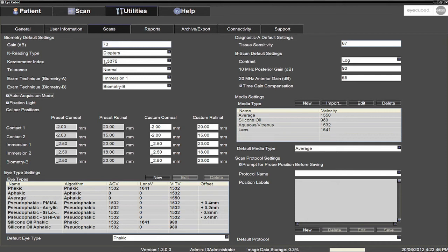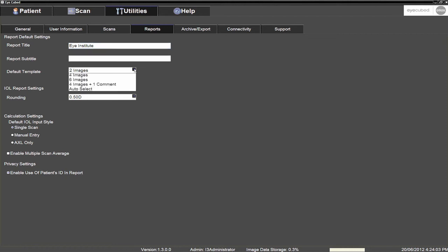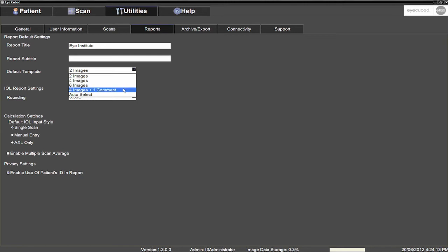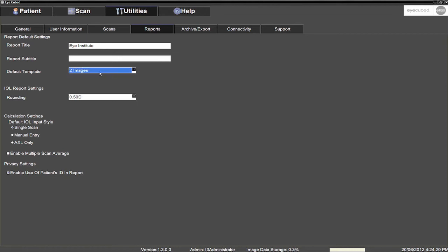In the Report sub-tab, the name of the clinic or hospital is usually entered in the Report Title tab, and the address of the clinic or hospital usually stands as the Report Subtitle. You also have the option to select the default template for your B-Mode reports. Please note that the more images per page, the smaller they will be, and consequently, the harder it will be to visualise the finest details on the printed images. The two images per page template is usually the preferred format.